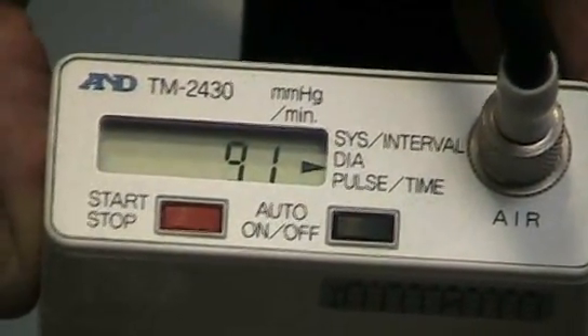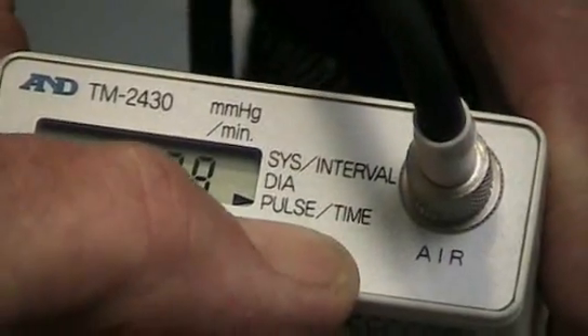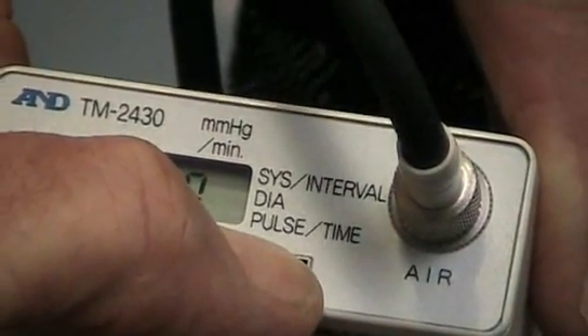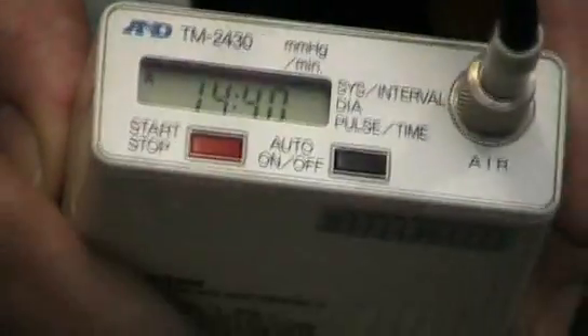After 24 hours the patient will return to the practice, and the procedure will be to take it out of automatic mode by again pressing the automatic button for four seconds, and the automatic sign will disappear. Now we can transmit that data to the computer and analyze the results.